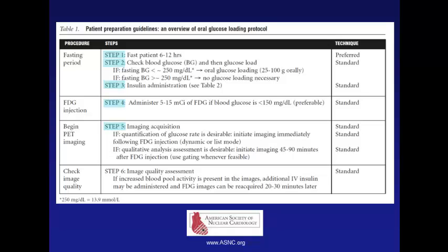Sometimes in type 2 diabetes, I have almost no uptake in the myocardium. It's important that you tell your techs, show me the images immediately, because you can see this, and you can rescan. You can add insulin, and then you can rescan. Half-life is 2 hours, no problem.